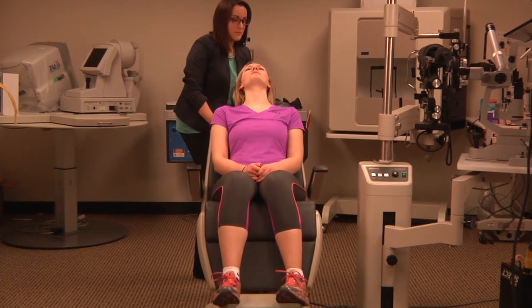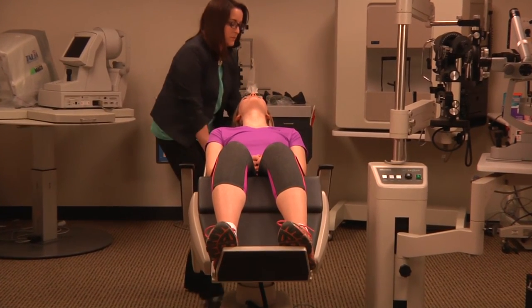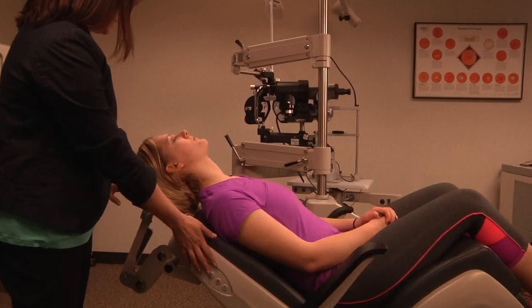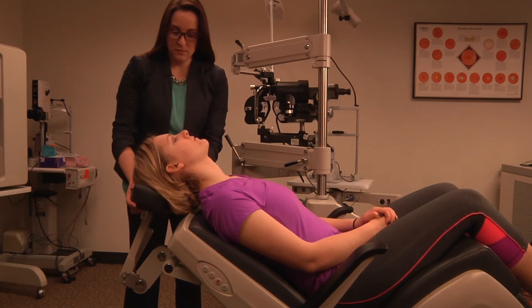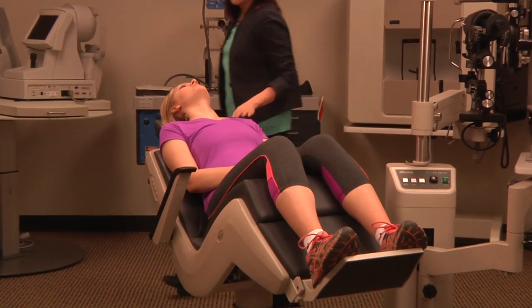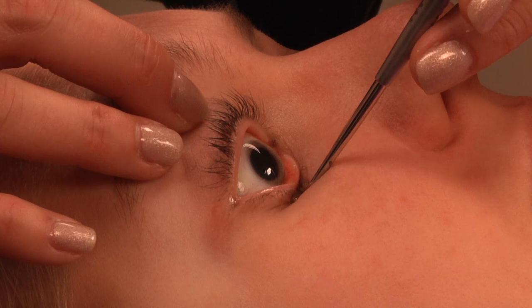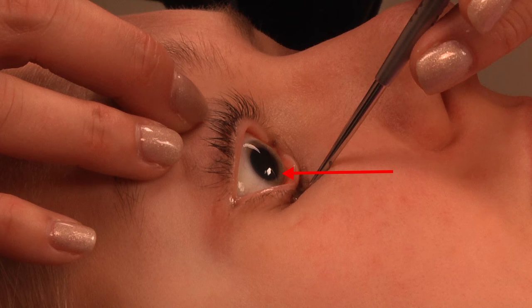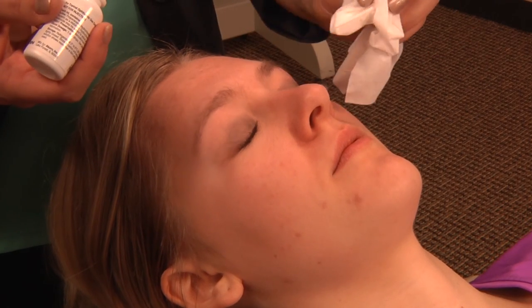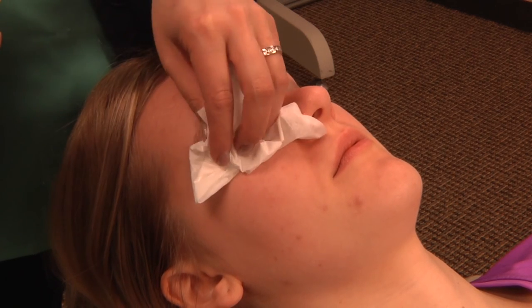To begin, the patient must be properly positioned. Recline the chair and have the patient lay back, with the head at hip level to maintain proper working distance. Ensure there is enough room for the doctor to move comfortably around the patient's head; the chair may need to be turned slightly. Ensure the patient's pupil is maximally dilated and not constricting to light. If dilation is not full, consider adding more drops of tropicamide 1% and/or phenylephrine 2.5%, or wait a few more minutes.